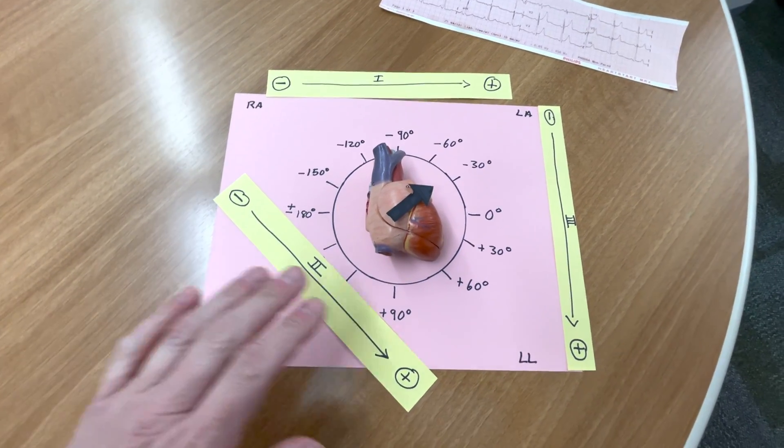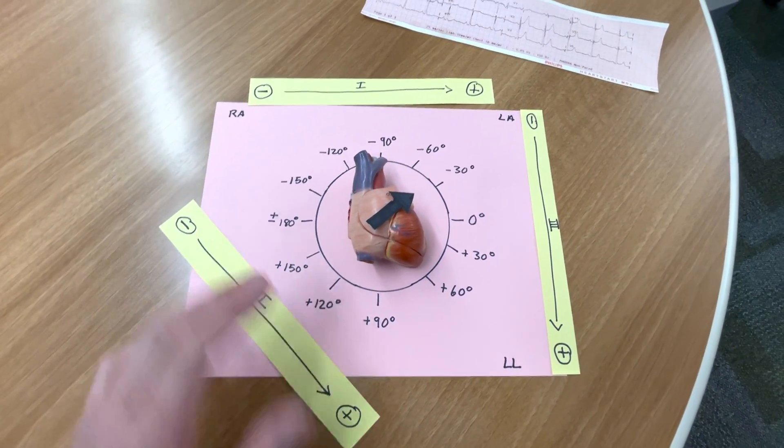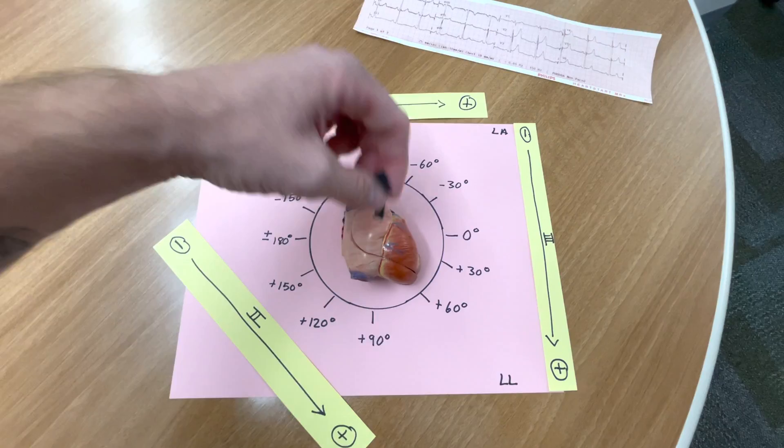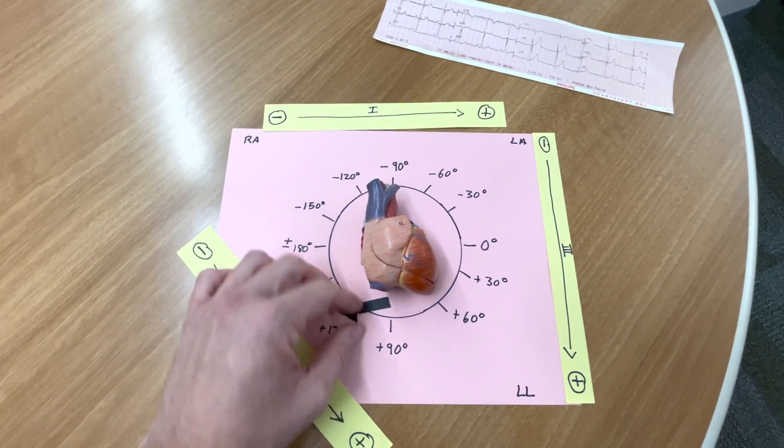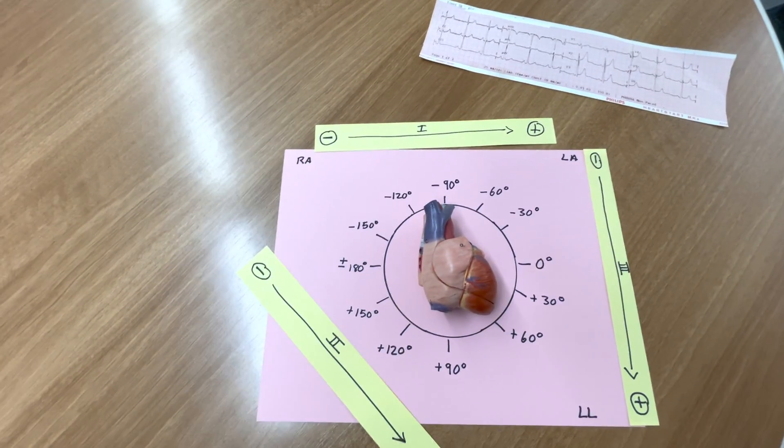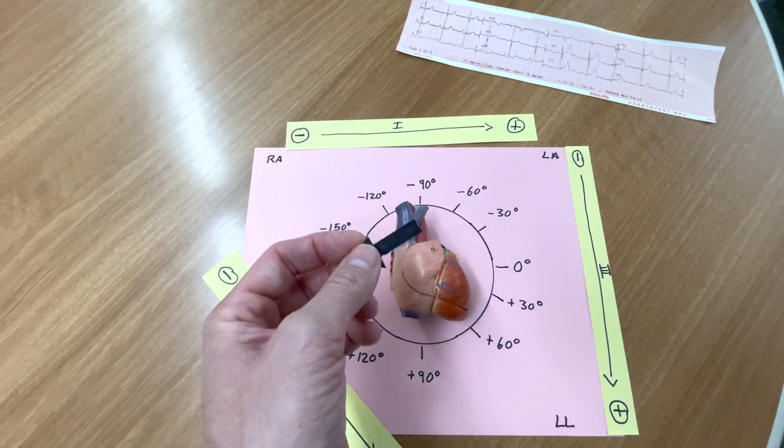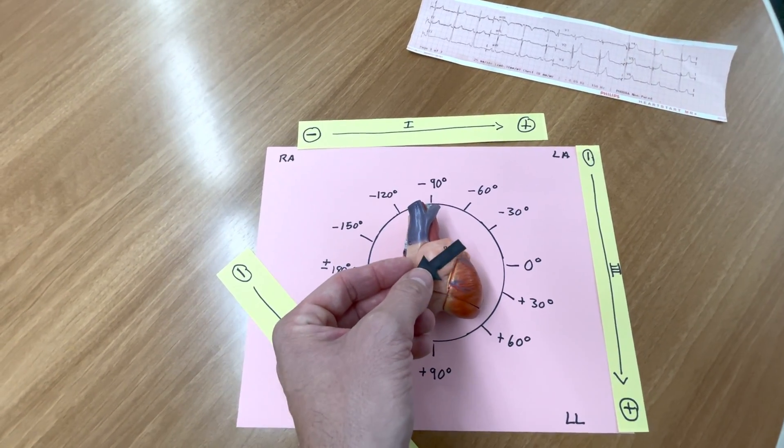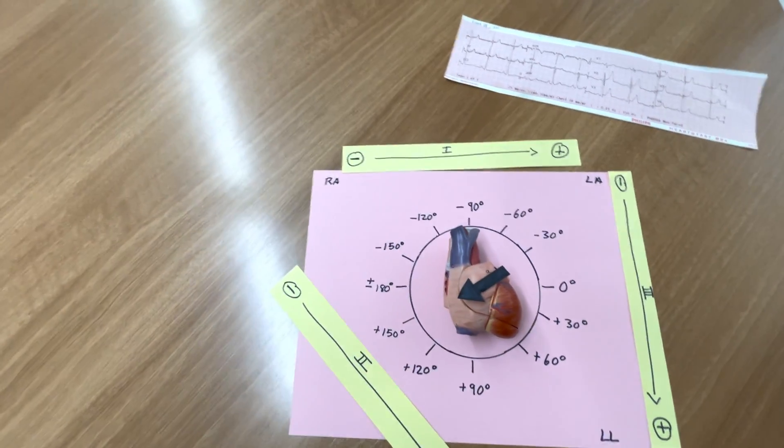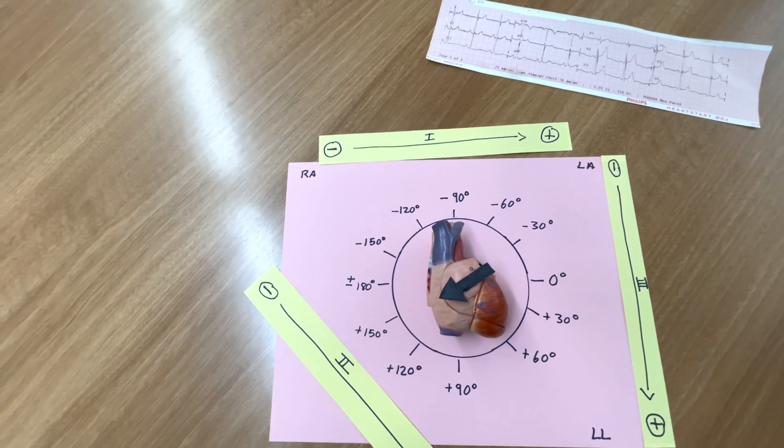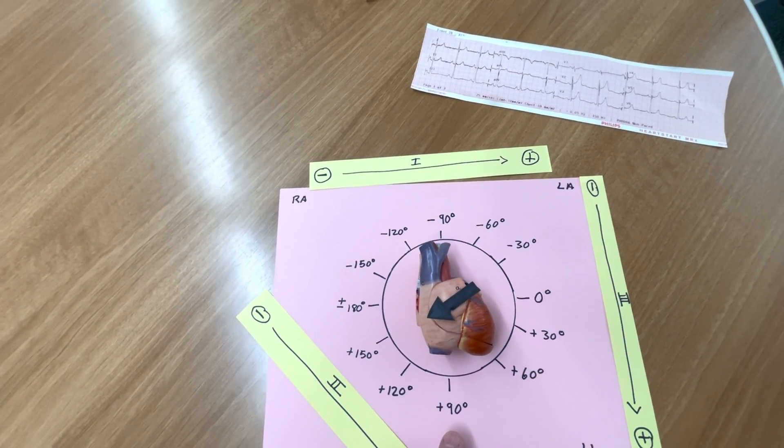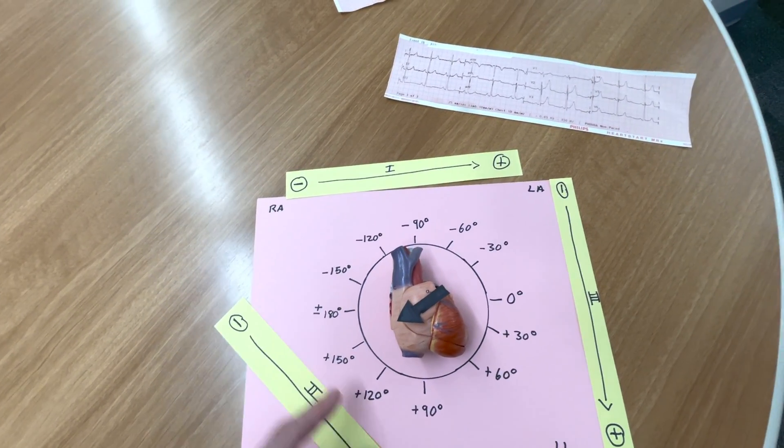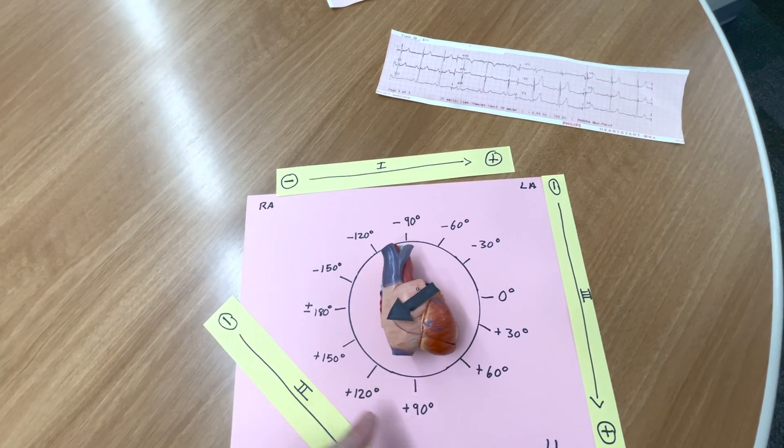So, let's talk about right axis deviation. Rightward deviations are going to be the arrow pointing in, see if I can get that arrow to stay on the heart, going to be that arrow, that mean direction of electrical activity moving in that direction.